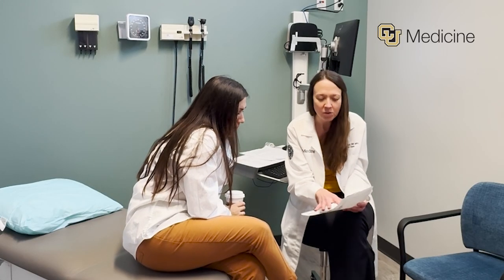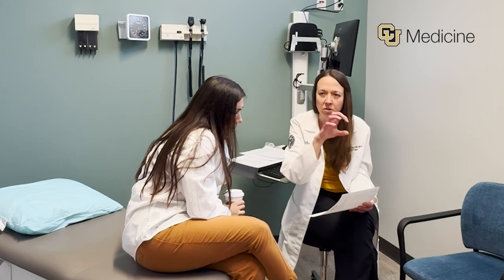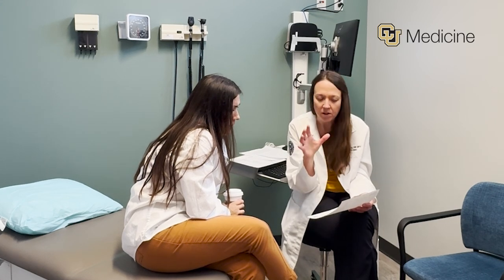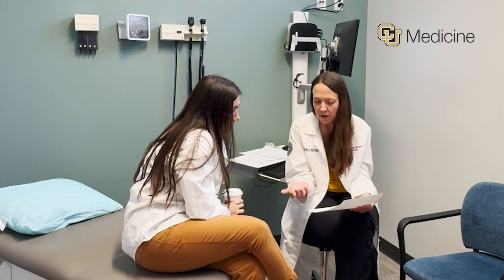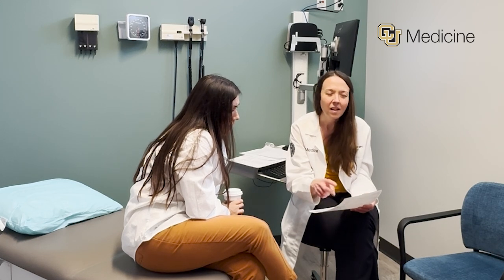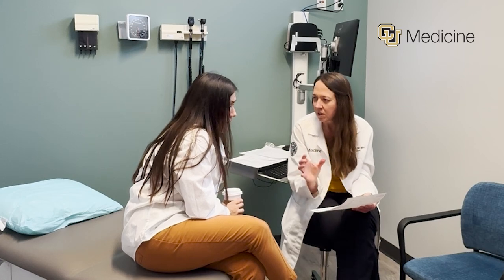The InBody score gives us an idea of the balance between your muscle and your fat within your body. The closer to 100 you are, the better. Ideally it should be greater than 80 — that's a good number to be at.